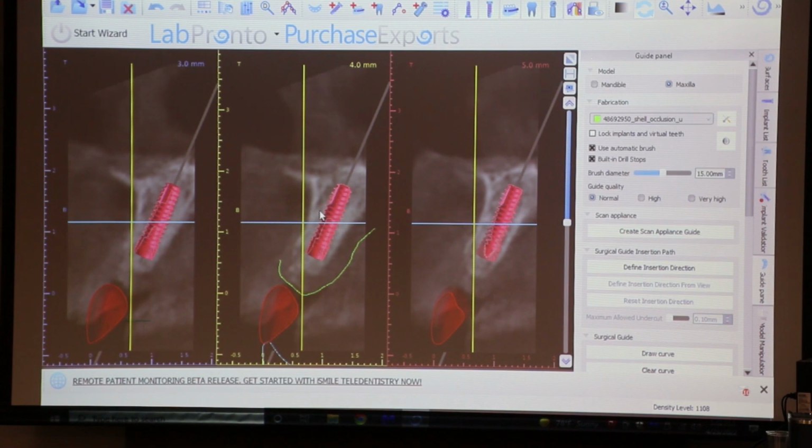But we're not going to be using a thick implant here. It's just going to be a thin 3.5. And if you have to choose, palatal or buccal, you want to be closer to the palate. The buccal is our bone that just seems to resorb all the time, really easily.